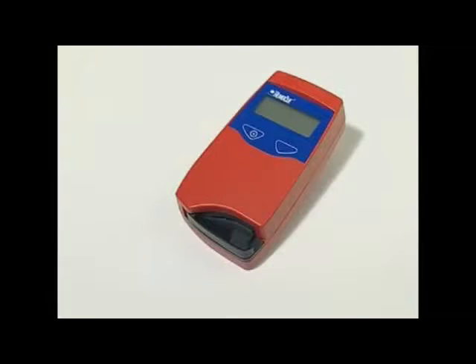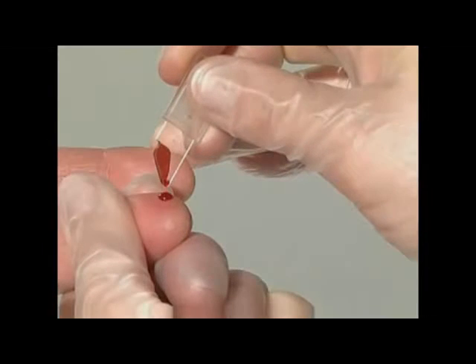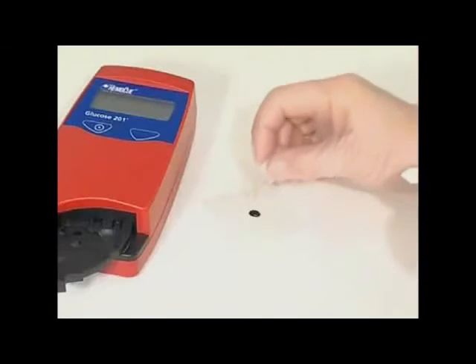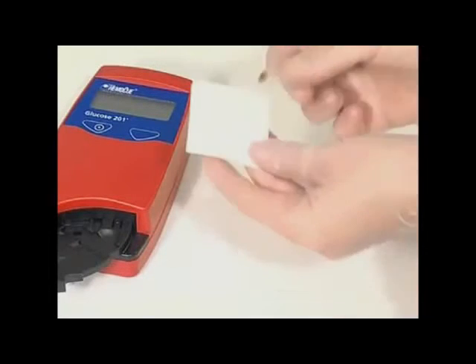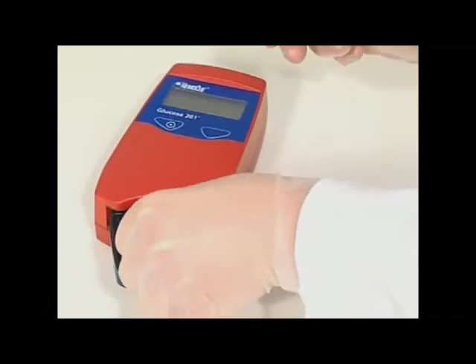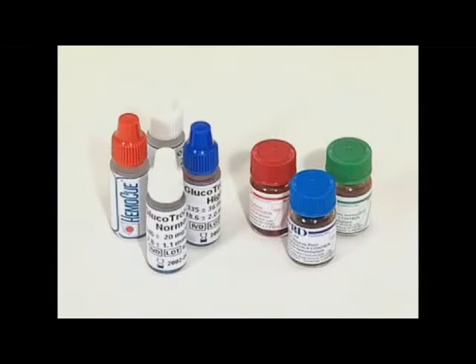Neither the analyzer nor the micro cuvettes can be replaced by another brand. The system can be controlled on the days of use or according to local recommendations with whole blood, hemolyzate, or other controls. To obtain reliable results, only use controls recommended by HemaQ.